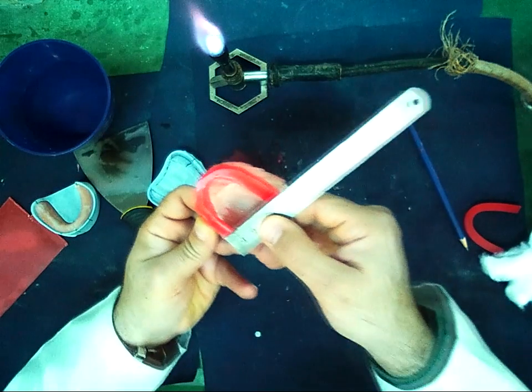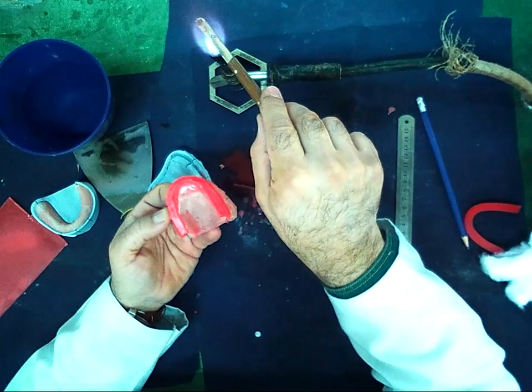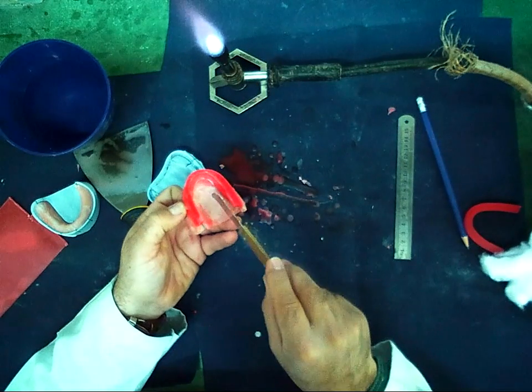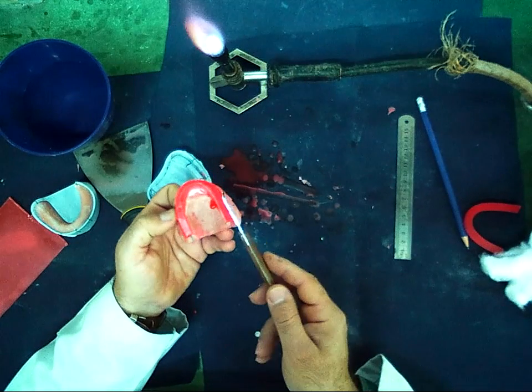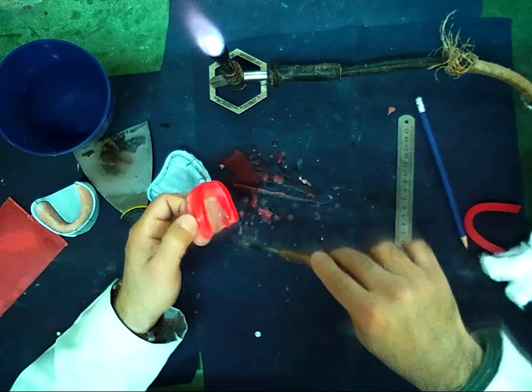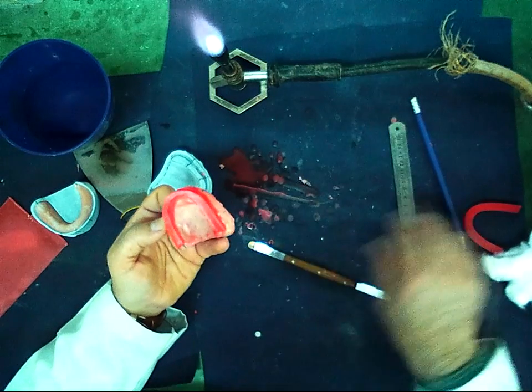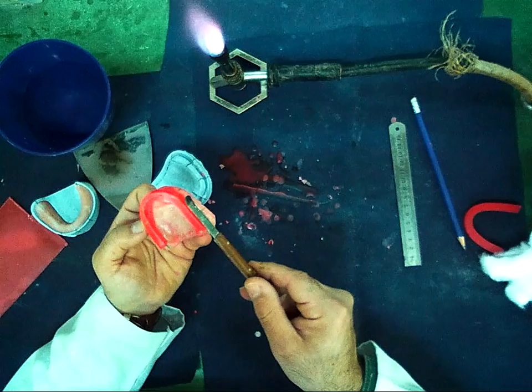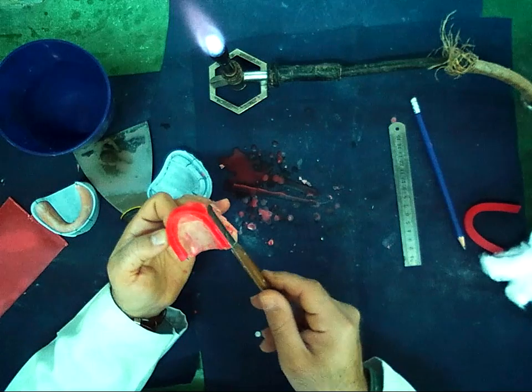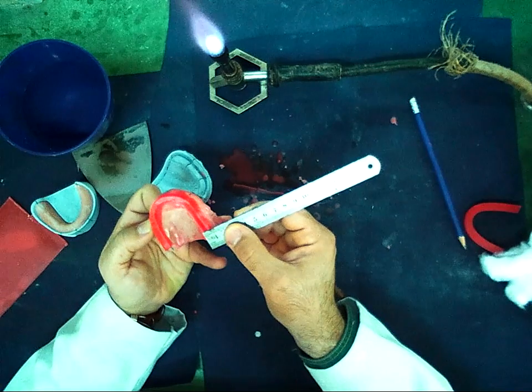It is 7 mm. The other side. It is 8. It is 7.